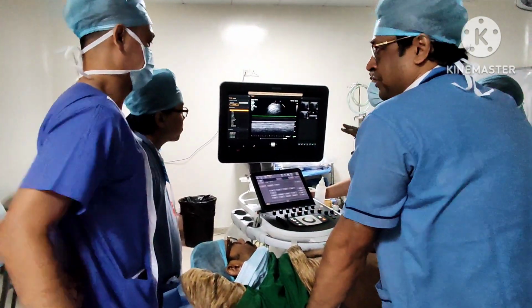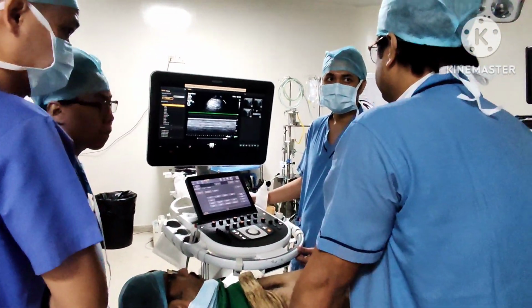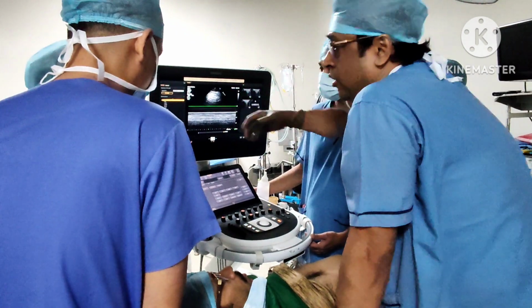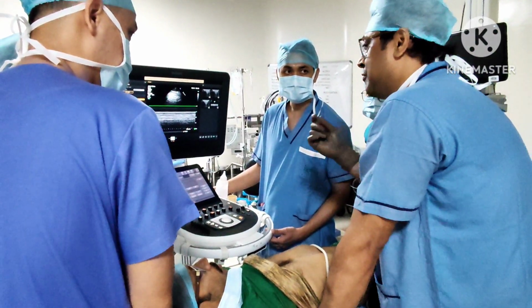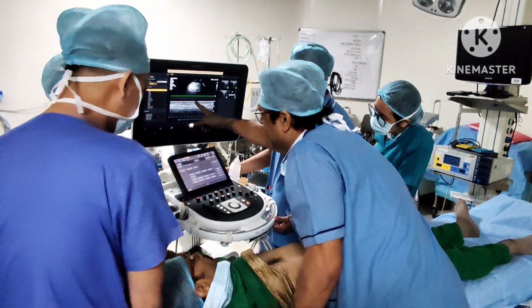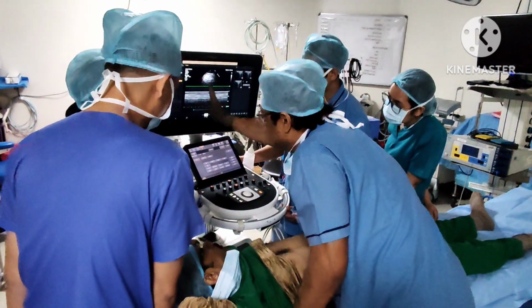Now, if you have a pneumothorax, what happens? Suppose we call it a lung point. The lung point is the point where we have a small anterior pneumothorax. So suppose you have a lung point over here. What will happen is you have a pneumothorax on this side, and this is normal. So you will see something like this picture over here.